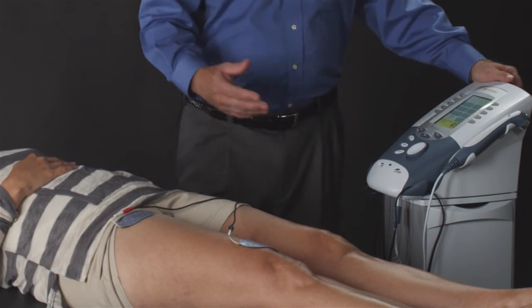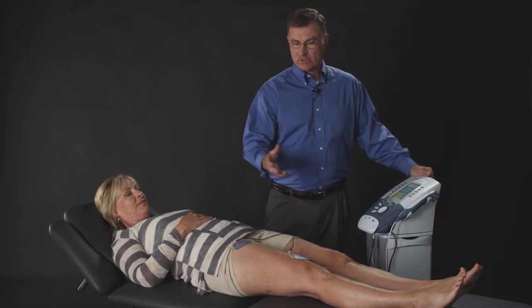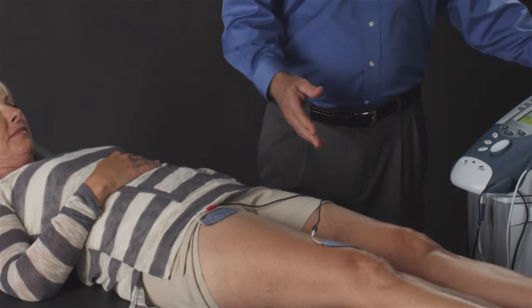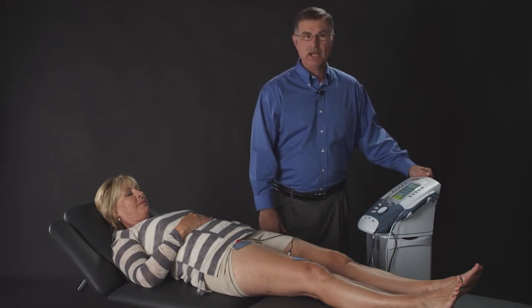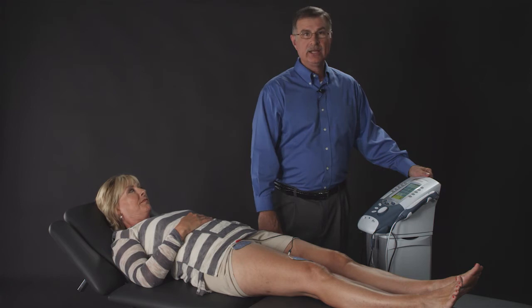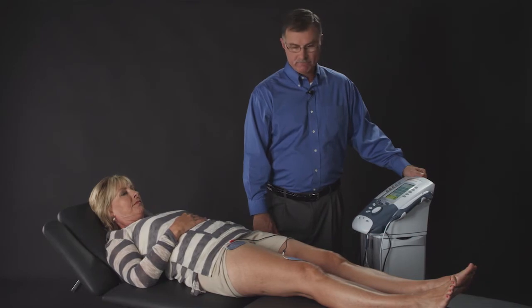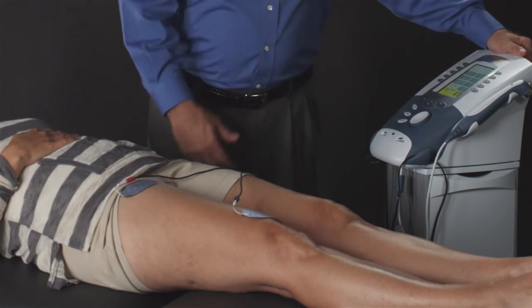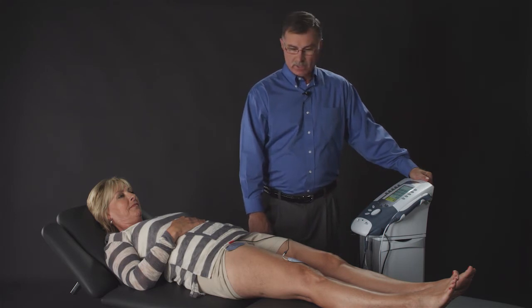We will instruct the patient, as the machine contracts, I want you to contract with the unit. When the machine turns off, I want you to rest with the unit. So she's contracted, now she relaxes. It is important during the relaxation time to reduce the fatigue of the patient so that they can achieve multiple contractions. As the machine then begins to contract again, we will instruct the patient to contract with the machine. The contraction will last for 10 seconds. And then when the machine stops, we'll ask her to rest again.